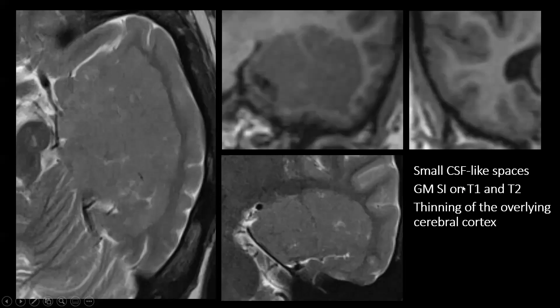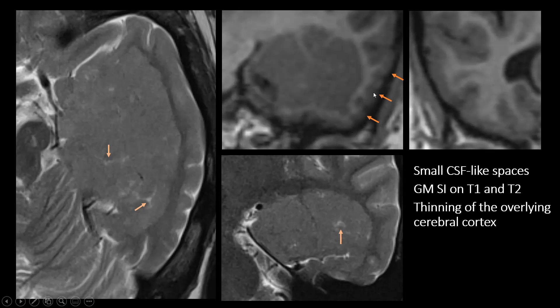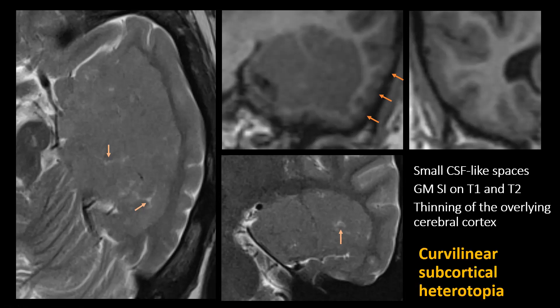This bulky mass-like lesion also has the same signal intensity as the cerebral cortex on both T2 and T1-weighted images. We see some very small cyst-like lesions interspersed in the lesion, and we also have some thinning of the cerebral cortex in the temporal lobe lateral to this mass-like lesion. This was not a tumor — this was a curvilinear subcortical heterotopia.